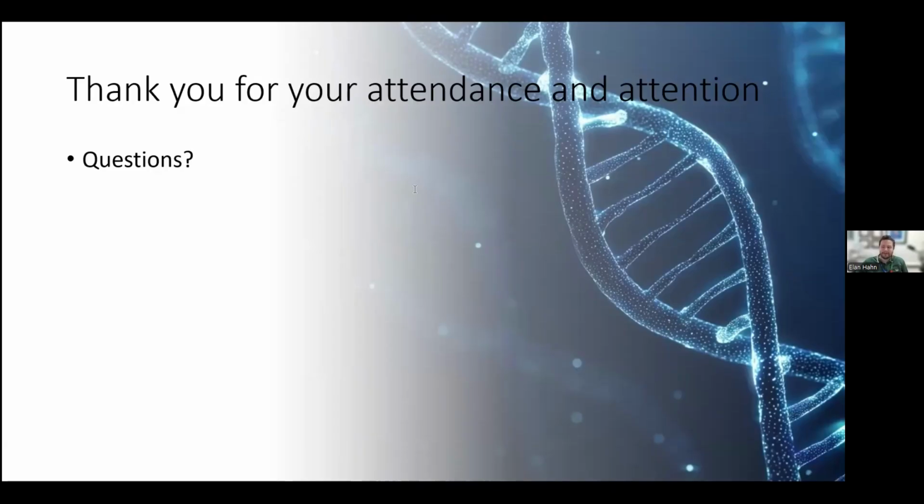So being aware of a POLE mutated or MMR deficient tumor, highlighting that mutation. But I think it is important to classify all of the significant variants that we find. If you want to limit it to the indicated gene list, that's sort of lab dependent on what you report in these cases and in cases in general.